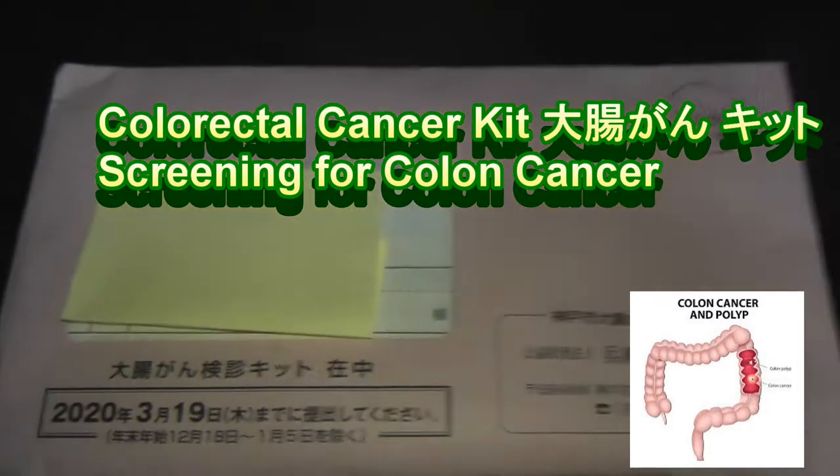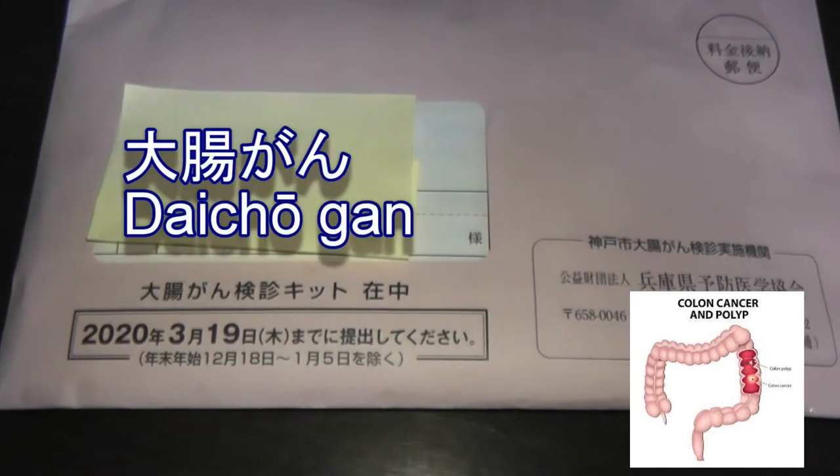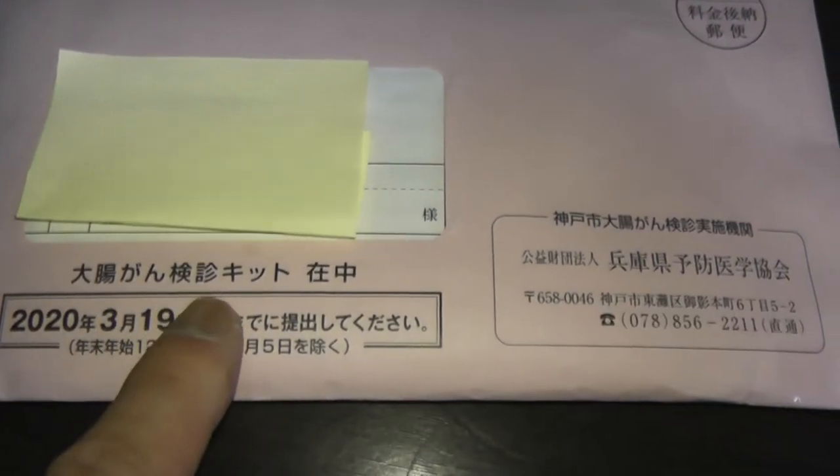Hi everyone, it's James in Japan. You're looking at an envelope kit. It's for colorectal screening. It says Daichougan Kensa Kit.